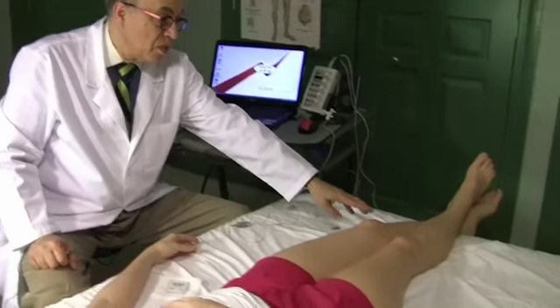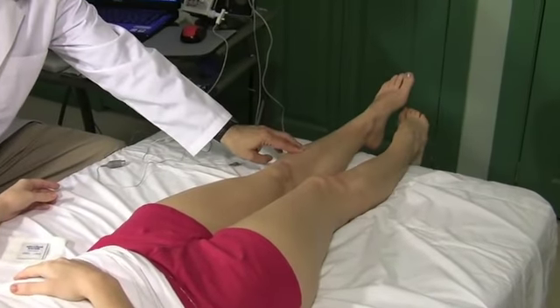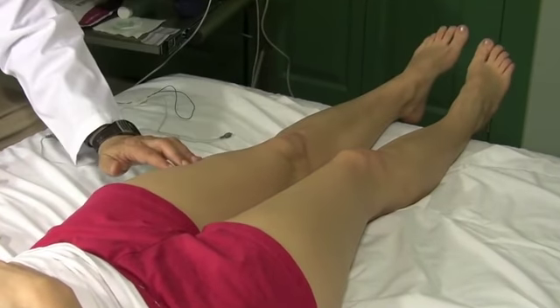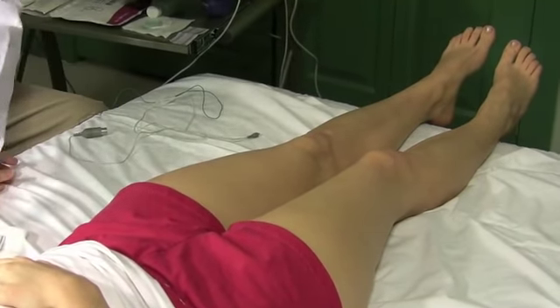In the leg, as a routine, I study the extensor digitorum brevis muscle, the tibialis anterior muscle, the medial gastrocnemius muscle, the vastus lateralis, and the lumbosacral paraspinals. I'm going to go over each one of these and describe them to you in detail. But I just wanted to give you first the list of the routine muscles that I study in the upper and lower extremities.